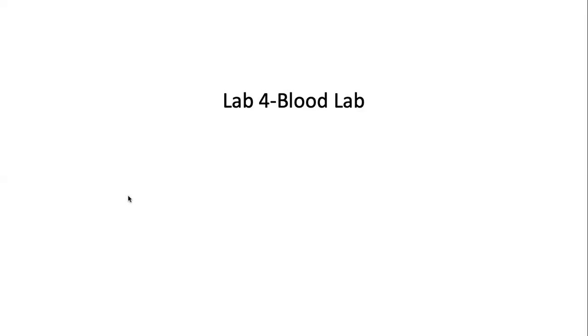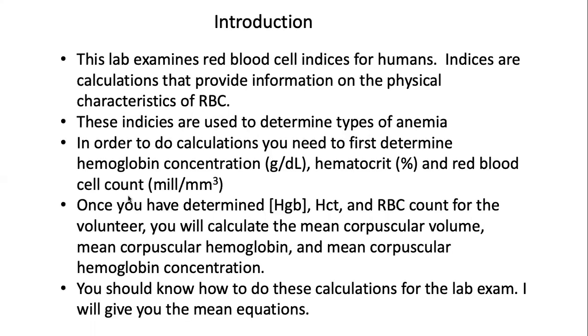Welcome back. Today we're going to be doing the blood lab virtually. This lab examines red blood cell indices for humans using some samples from McGill University in Canada and a volunteer's blood.